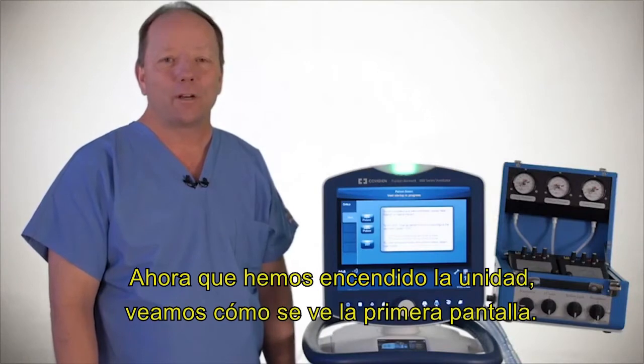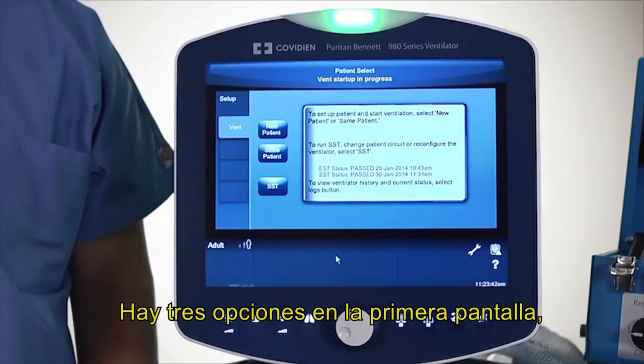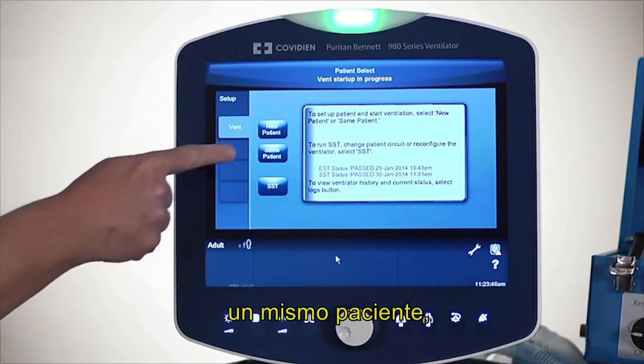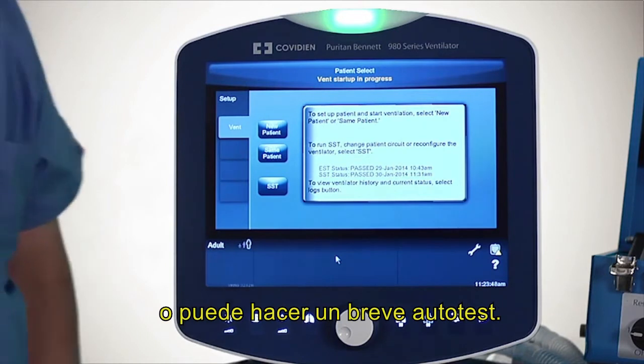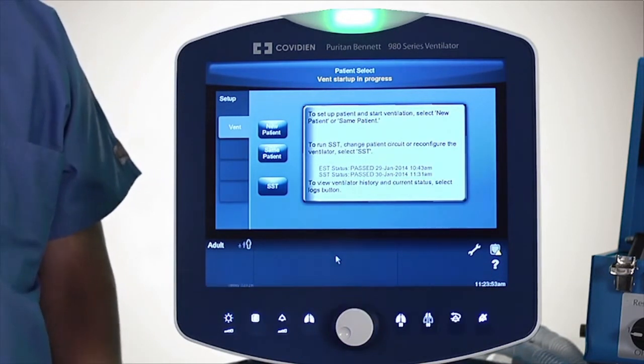So now that we have turned the unit on, let's go through what the first screen looks like. You have three options on the first screen. As you can see, you can either do a new patient, a same patient, or you can do a short self-test. I'm going to run you through starting a new patient at this point.